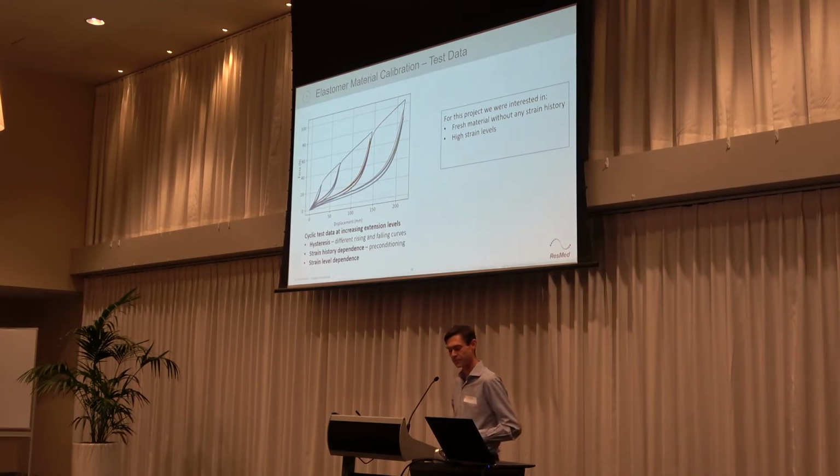levels. So one of the neat things about this test, though, is that you might notice from the first cycle at each strain level, the elastomer, when it goes into sort of a new strain history, or it propagates into a new strain history, that the curves continue from where the previous cycle left off. So let's see, does this pointer work? So we can see here it's sort of stabilized around here, and then the next time we come up, we follow up under here and then follow that new curve.